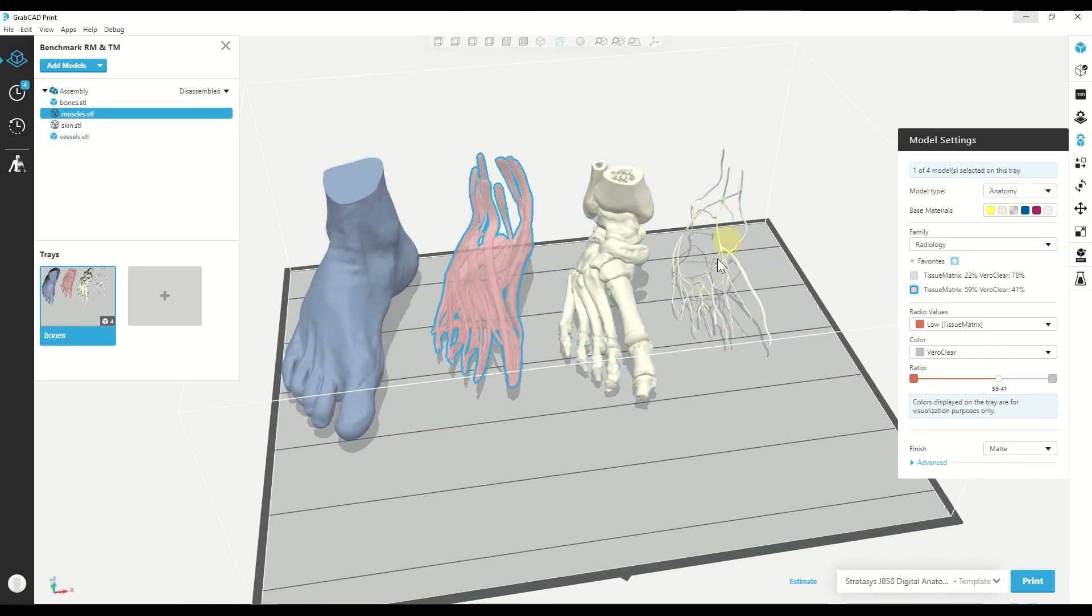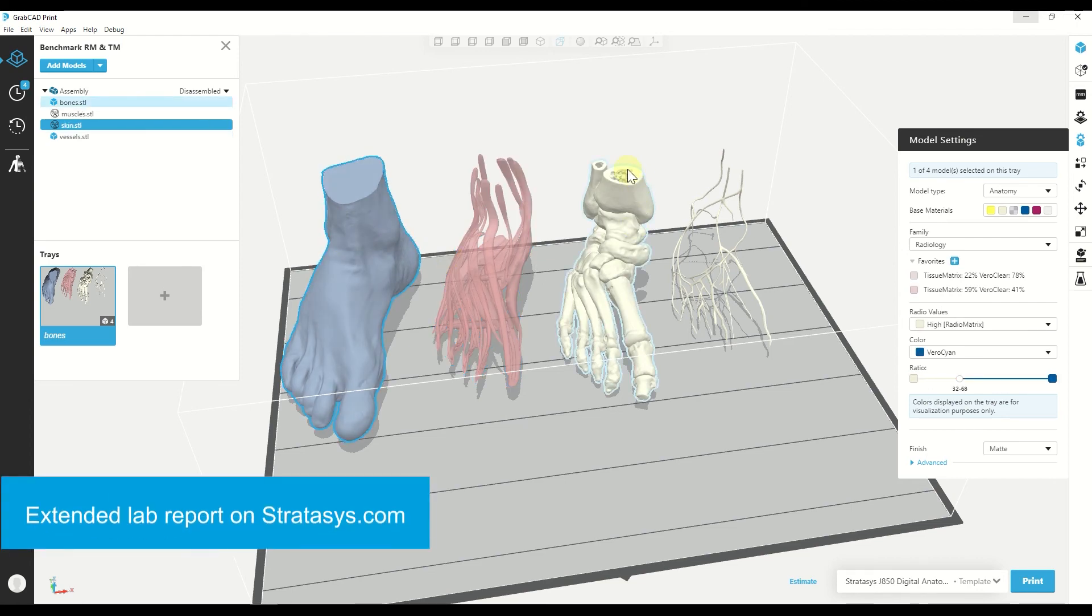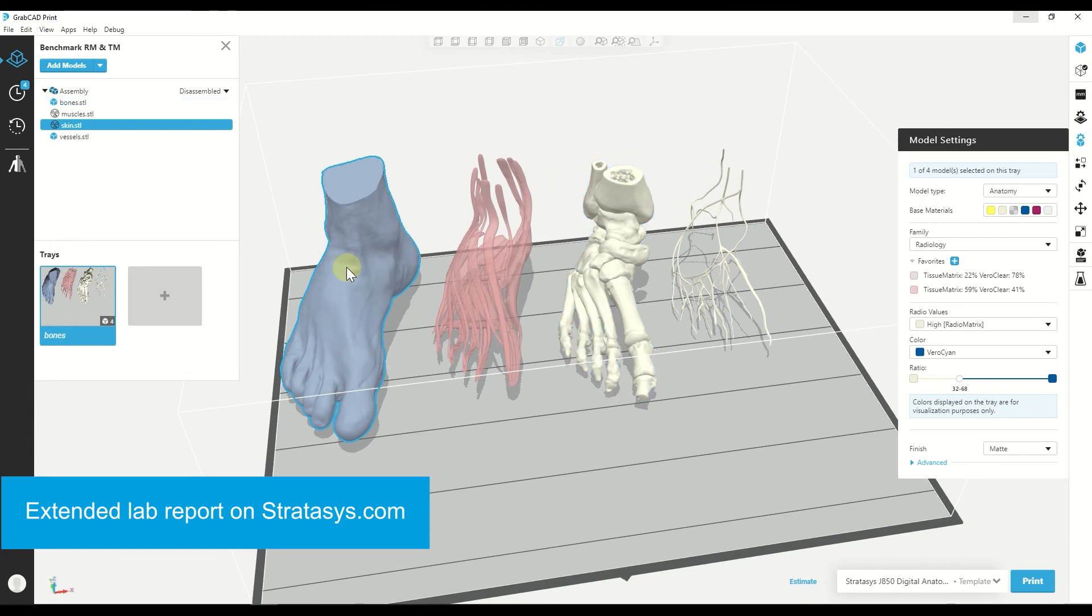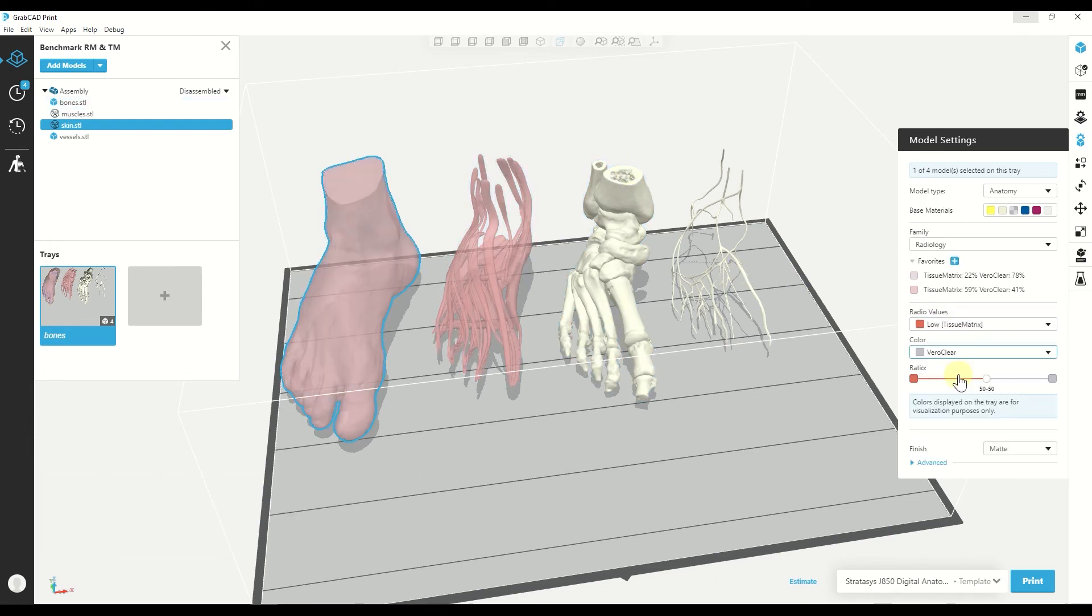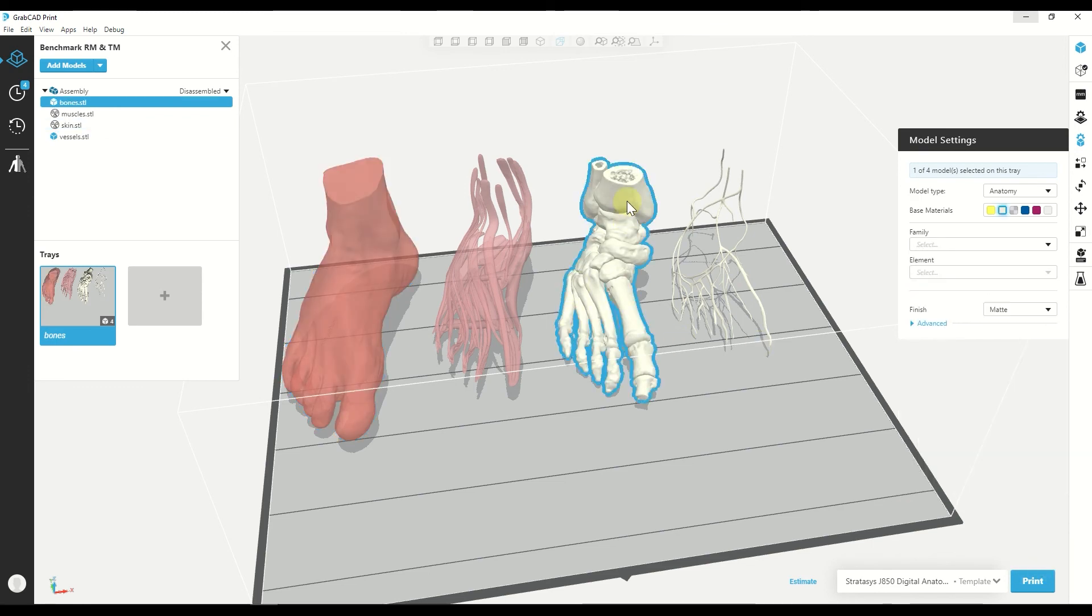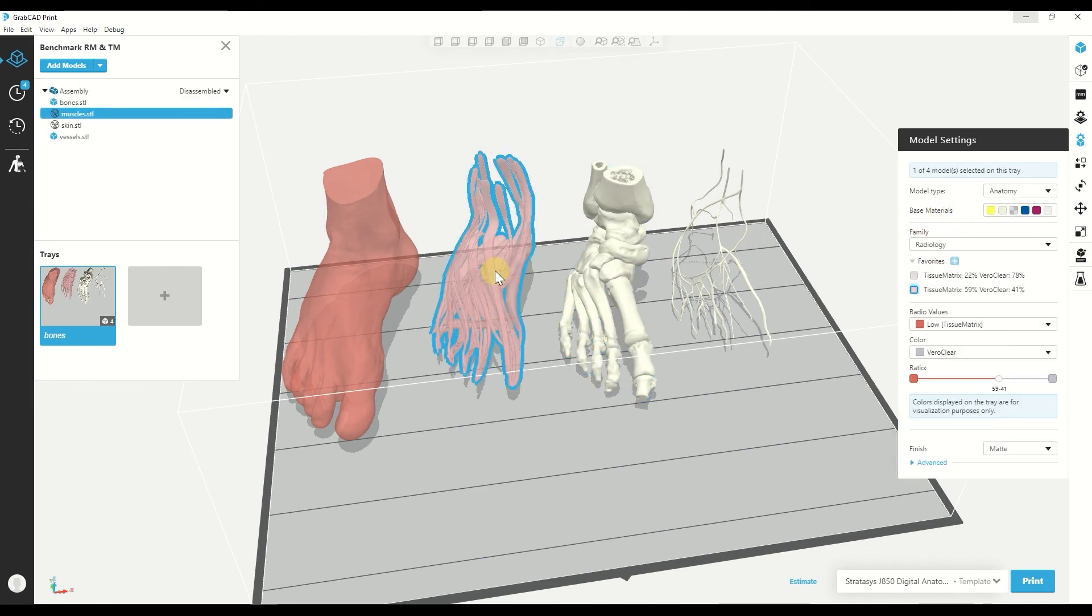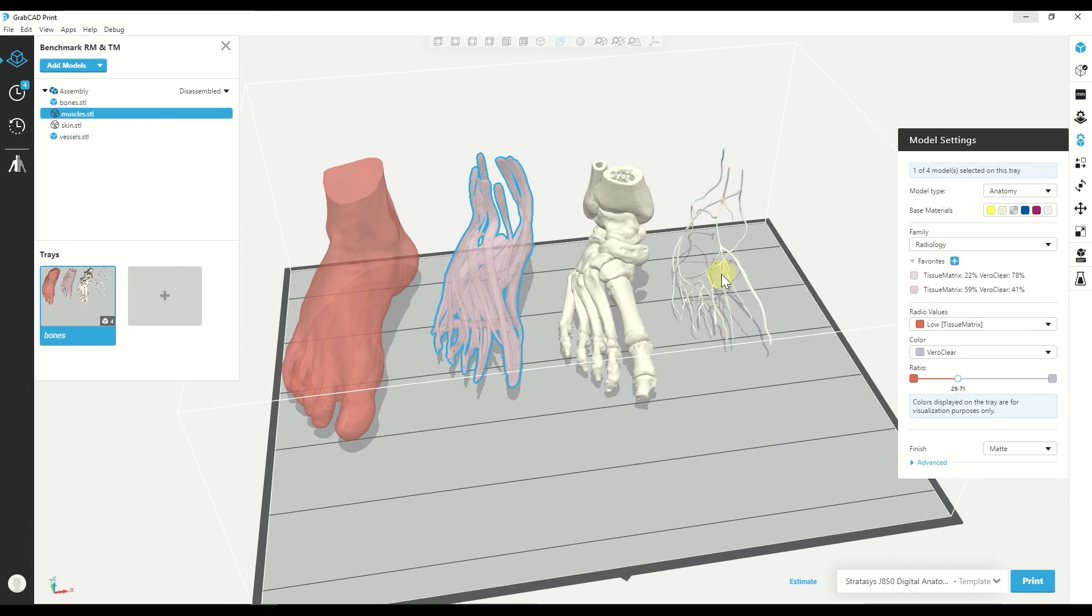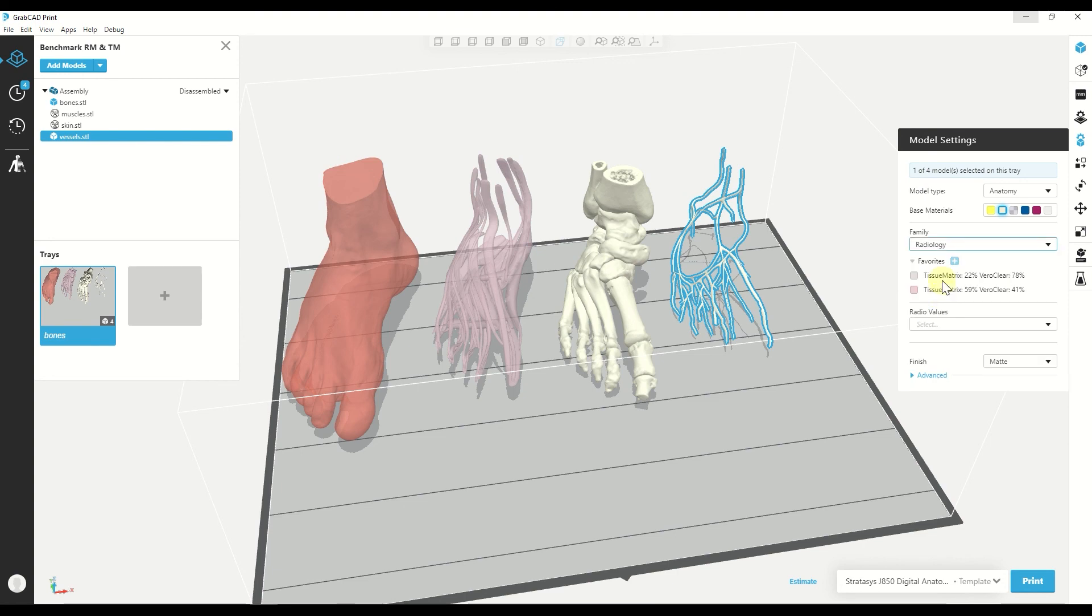For each part, I can choose the material mixture according to the lab report that we have. So for example, for the fatty tissue, I will use low radio values. For the bone, I can use high radio values, which is pure radiomatrix. And for the muscles and vessels, I can just pick a mixture and go scan it and see what comes up.